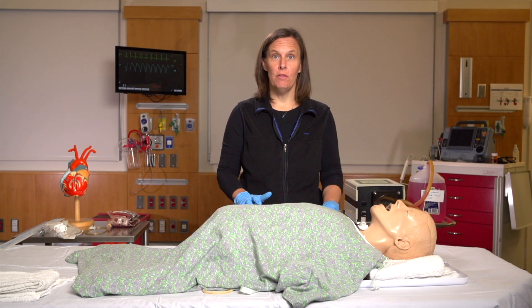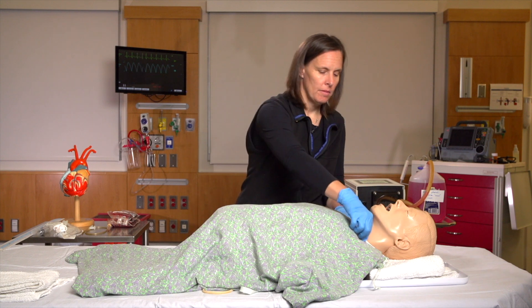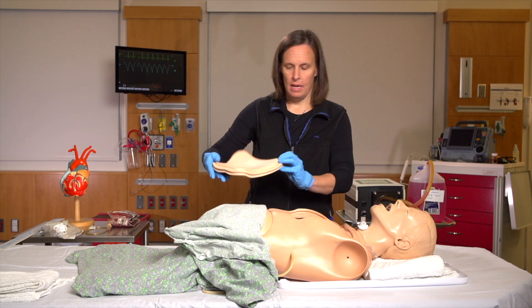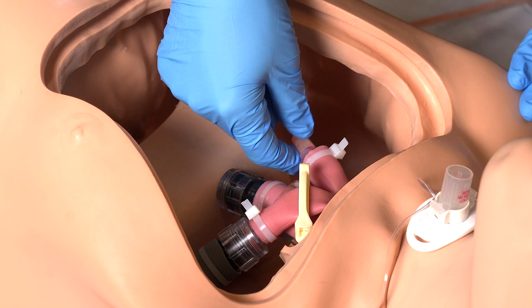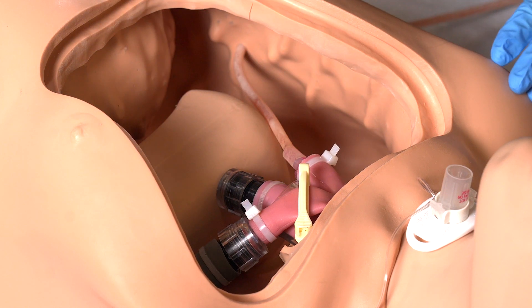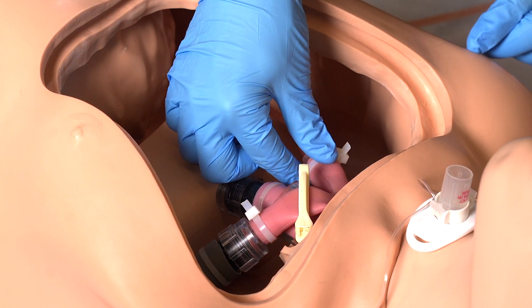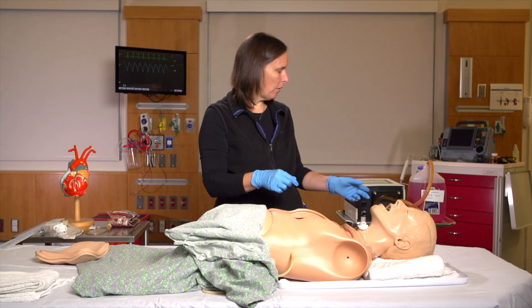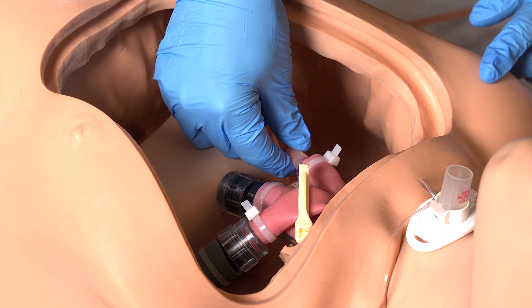Now let's talk about some of the modifications we made to Arthur himself. The first thing you want to do is remove the chest plate. Inside the cavity, you're going to remove his right lung. In place of that, you're going to connect the right main stem to a 6.5 ET tube adapter. You're then going to connect the pump tubing from the pump itself to that adapter.